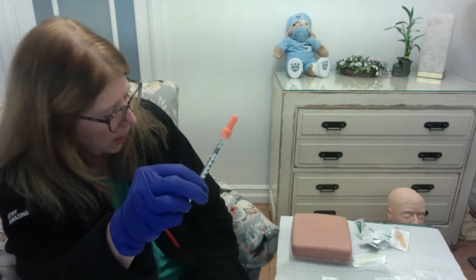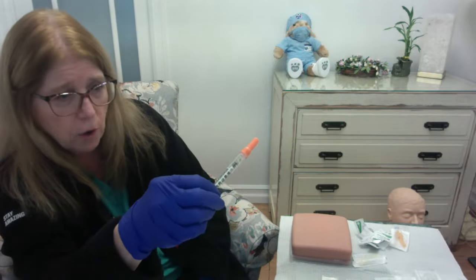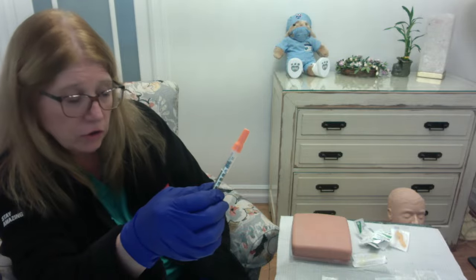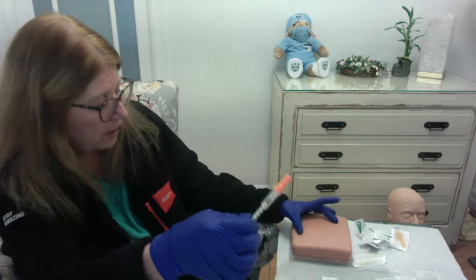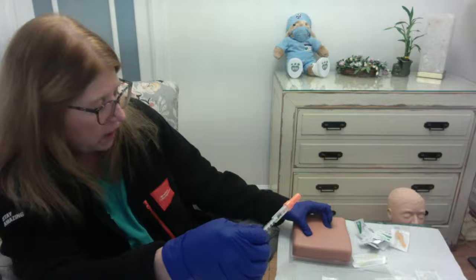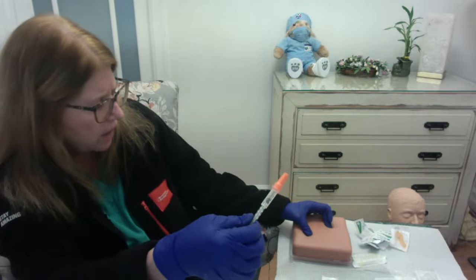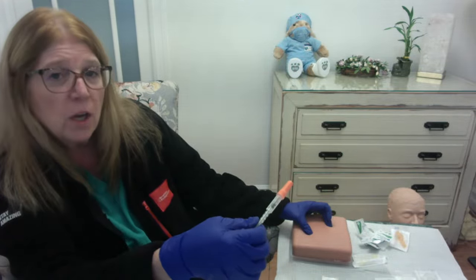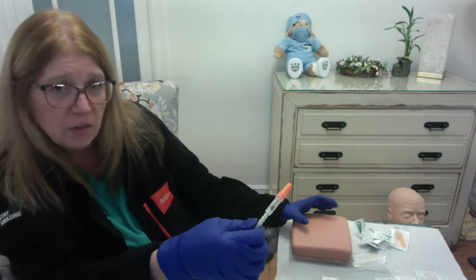So I am going to explain to the patient what I'm doing while I'm waiting for that alcohol to dry. Remember I said for intradermal we're not doing anything to the skin, but for subcutaneous we are going to pinch the skin, as if you're trying to gather up the fat. We're going to hold that pinch while we inject, and then we're going to release the pinch before we take the needle out. And hopefully that makes sense to you, right?